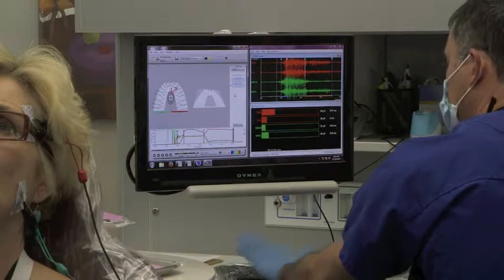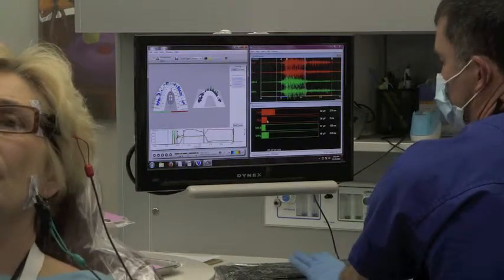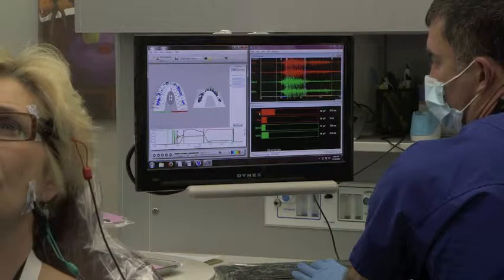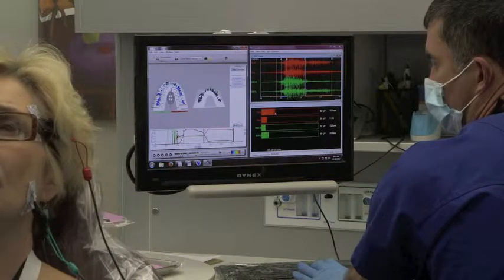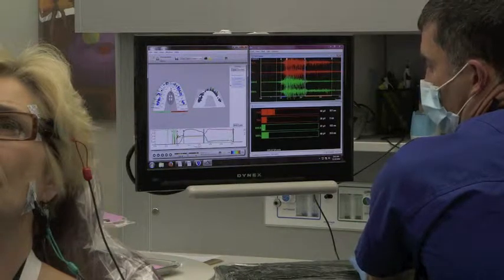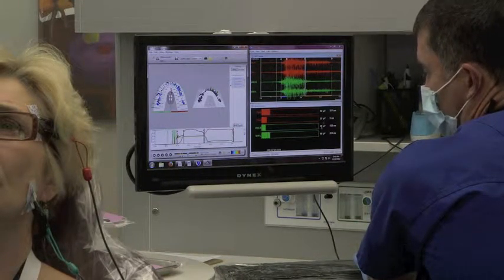In addition, look over here on the muscle side — that was bite. Here on the muscle side, you're swinging right. Trust me when I tell you, this muscle should do the work, and it is. This one should shut off. And these should be pretty quiet — below 8 to 10.